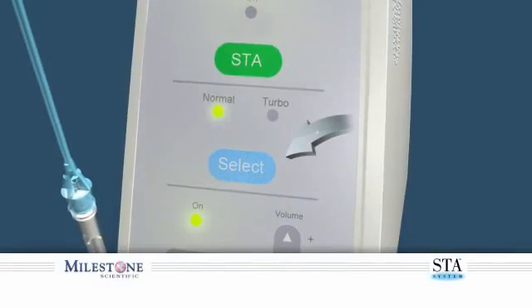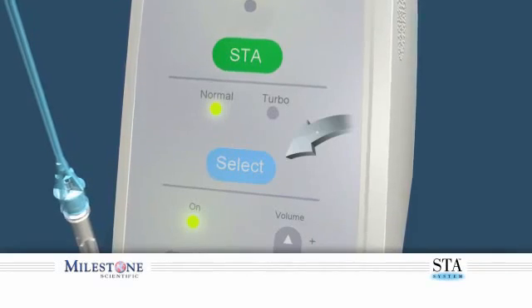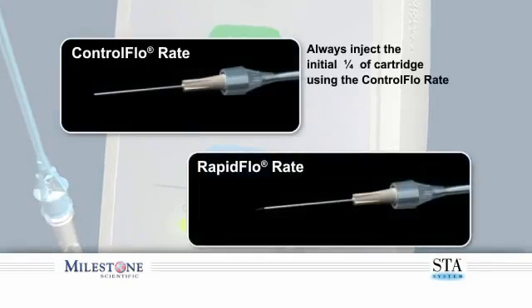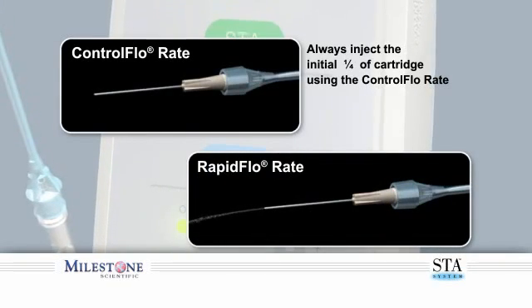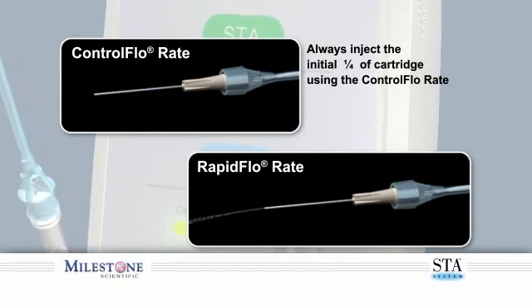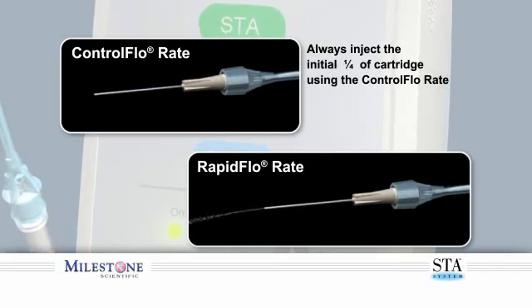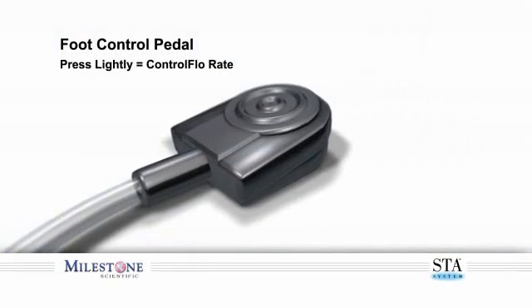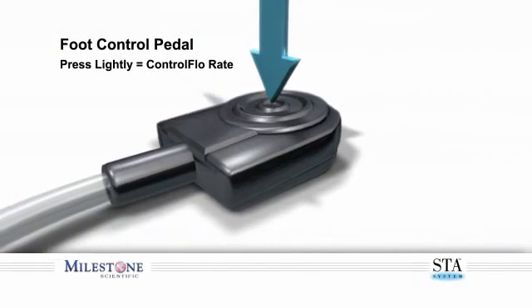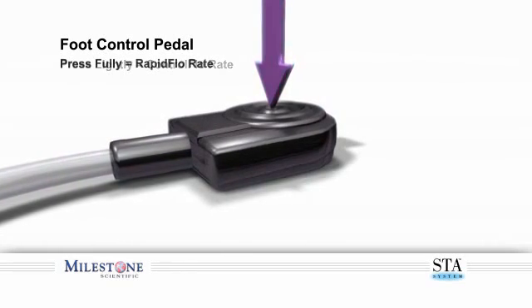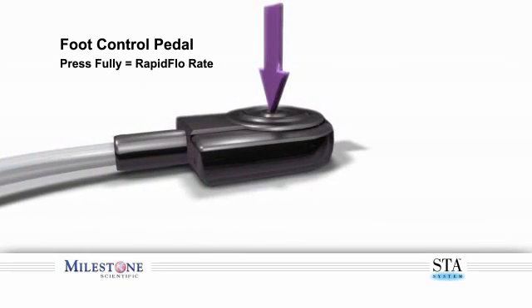Set the STA system to the normal mode, which allows the STA system to function with two distinct flow rates: the control flow and the rapid flow rate. We recommend using the control flow rate for the first quarter of the cartridge for all initial phases of infiltration and block injections. Depressing the foot control pedal lightly allows you to enter the control flow rate, and fully depressing it allows you to enter the rapid flow rate. There is a corresponding beeping tone to distinguish these two rates.